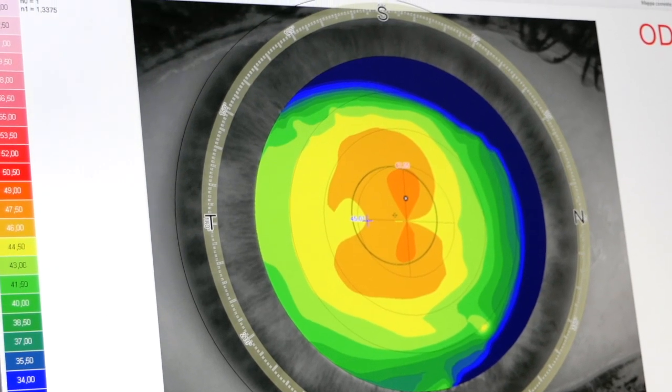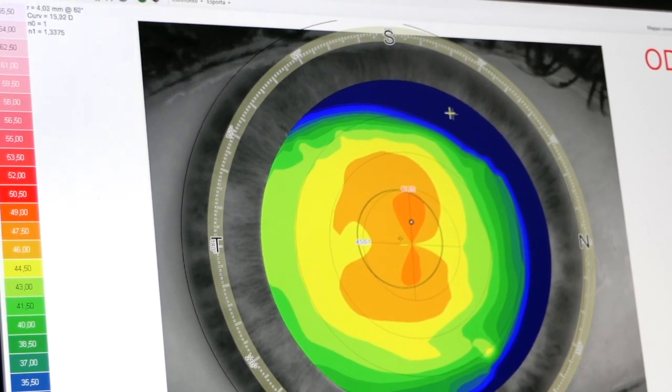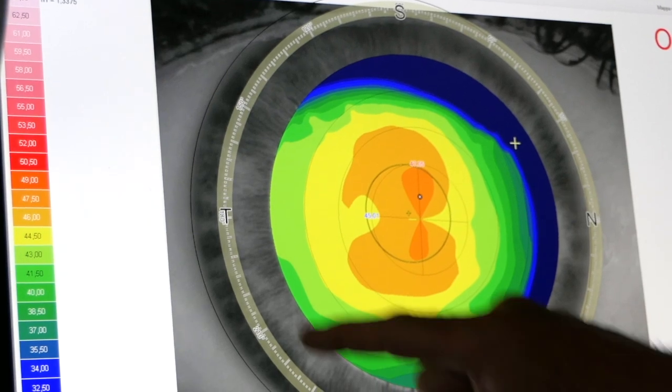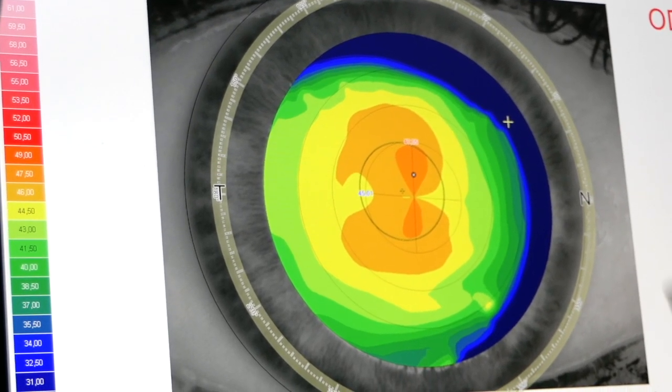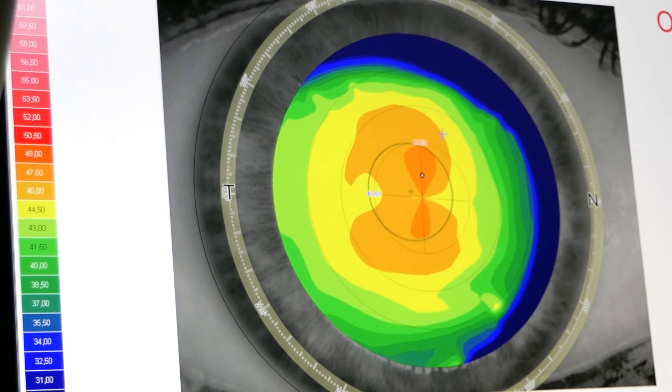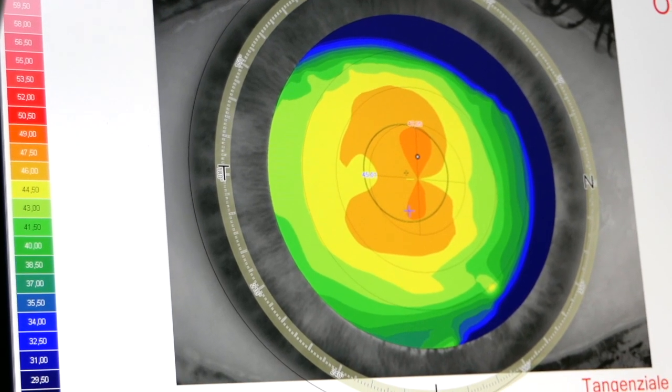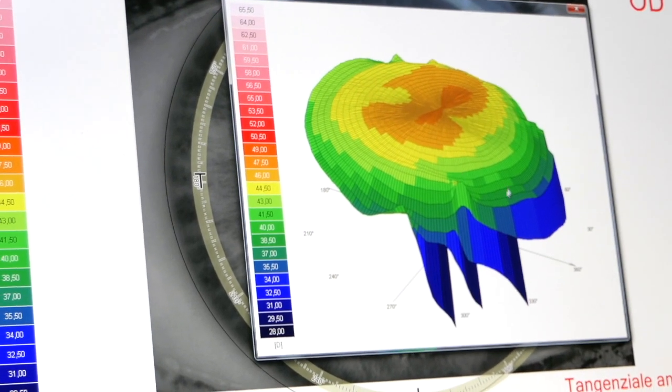Therefore, we have a cornea that is flatter in the periphery, the outer part, which then goes to merge with the white part of the eye that is flatter, while the central part is more curved.